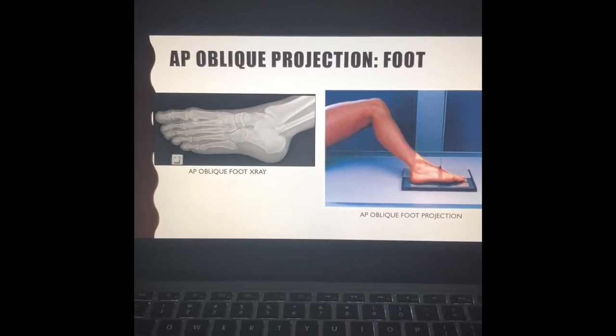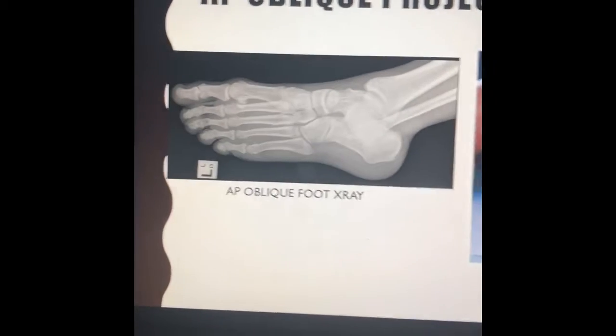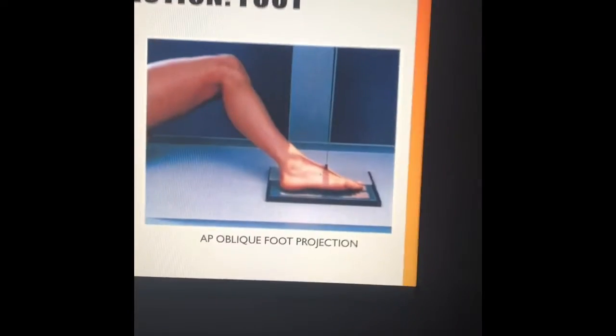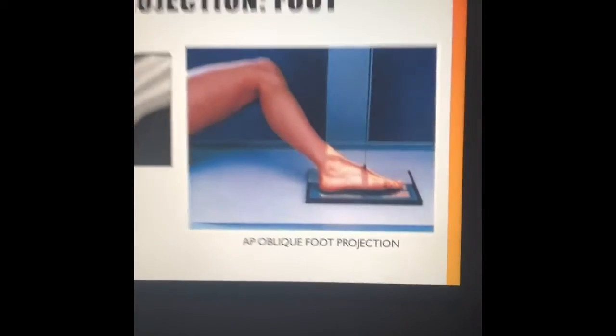The AP oblique projection of the foot. This is an AP oblique foot x-ray. This is an AP oblique foot projection.